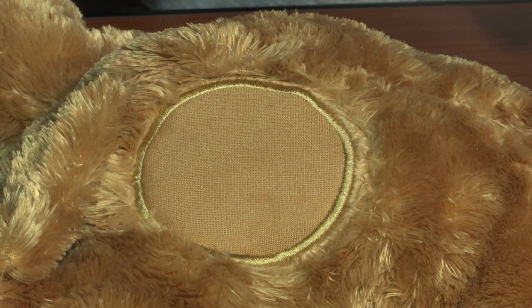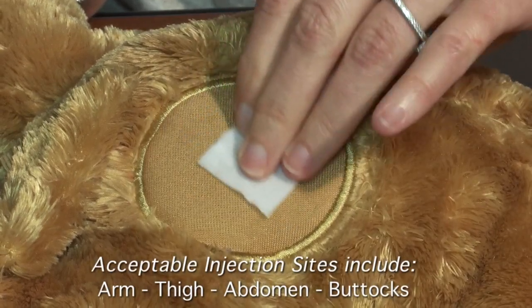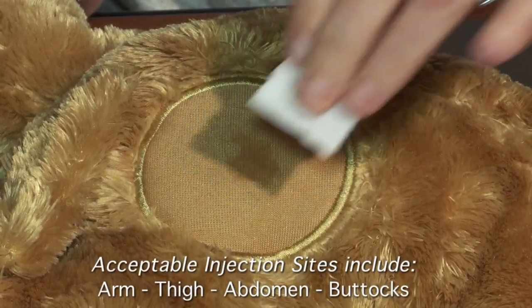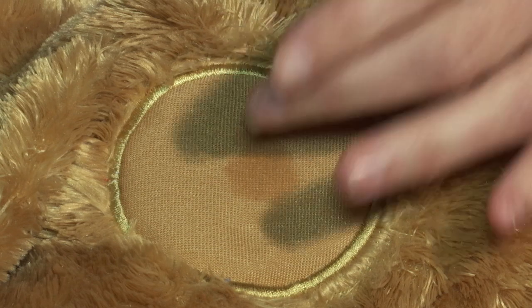If visibly soiled, wipe the injection site with alcohol. Acceptable injection sites are the arms, thigh, abdomen, or buttocks. The pen needle is so small that no pinching of the skin is usually necessary, but you can pull the skin taut for comfort if desired.